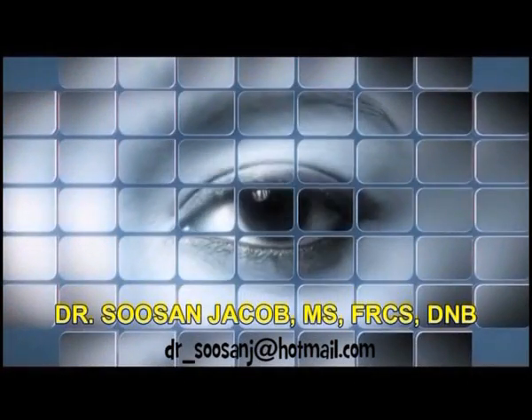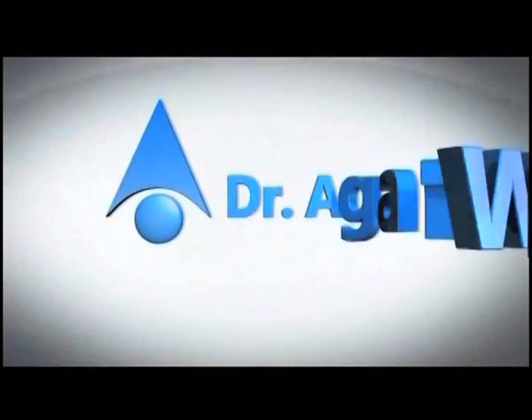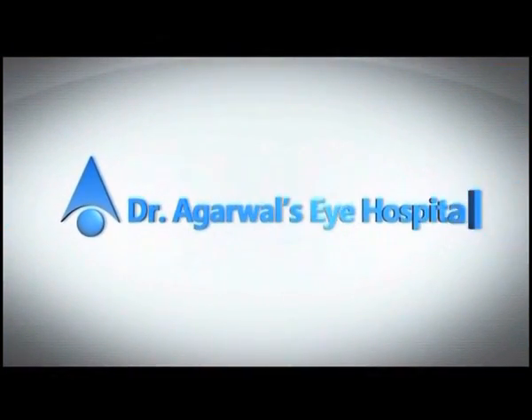Hi, I'm Soosan Jacob and I'm going to show a case of a tucked-in lamellar keratoplasty, or TILK, as first described by Vajpayee, Tyagi and Sharma et al. in 2008.